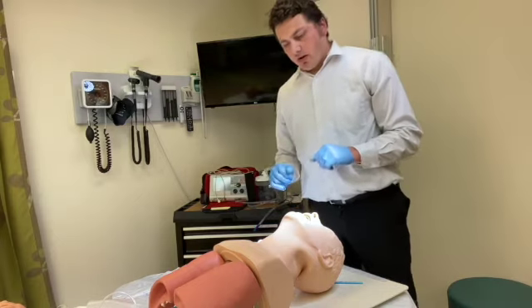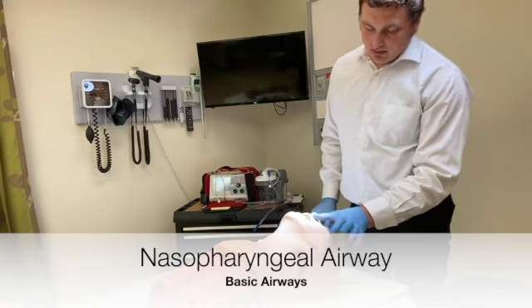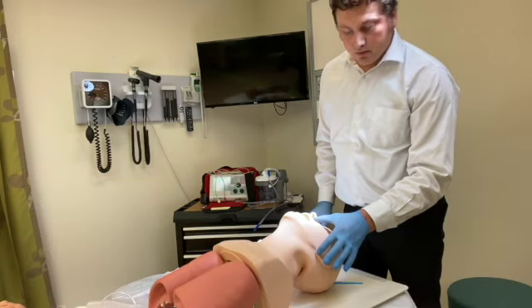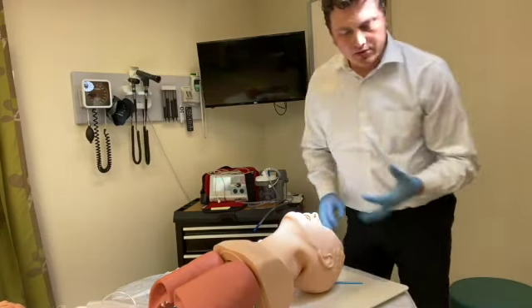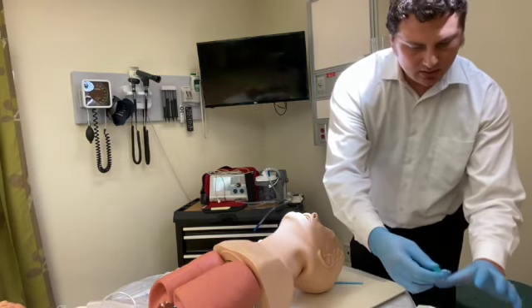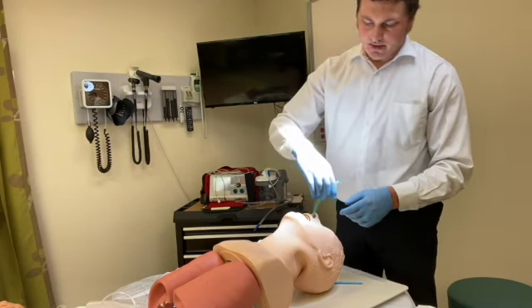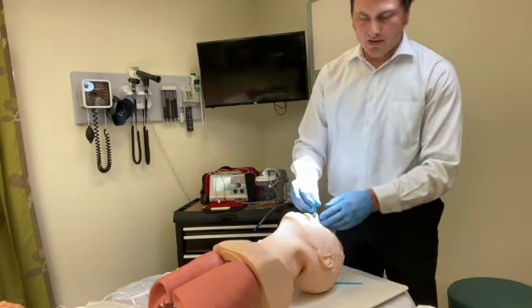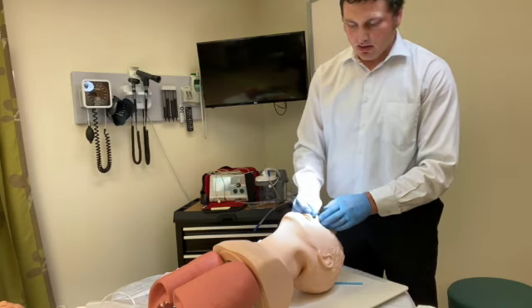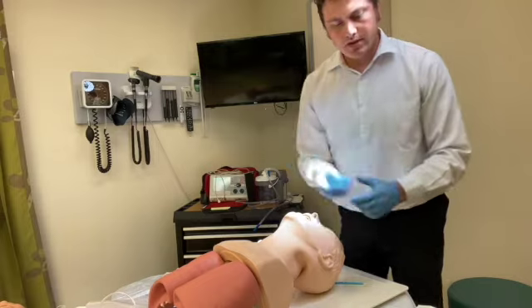Next, nasopharyngeal airway, which you measure from nose to earlobe. Okay, so I have it measured out with my hand, and the one I'm picking out right here would be good. So you want to have it facing upwards into the nares, turn around, and through like that. Okay, that's your nasopharyngeal airway.